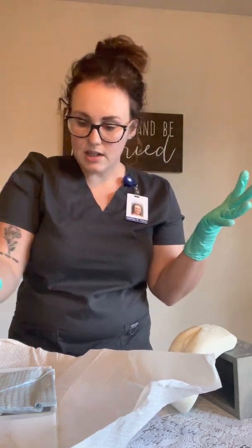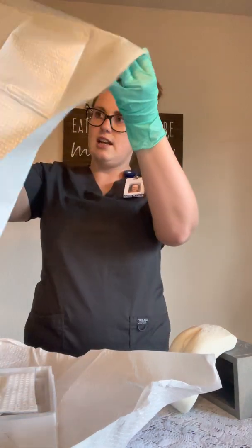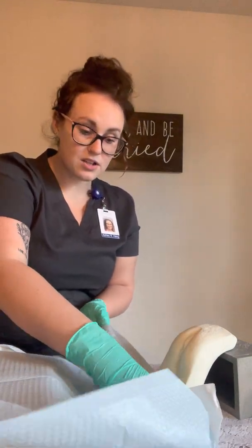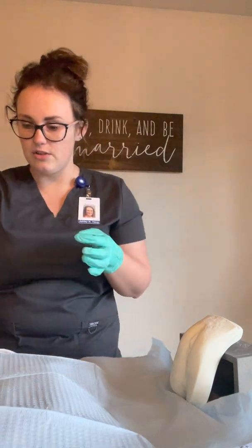Okay, so now that I'm sterile, I'm going to take the drapes, just touching the corners, and I'm going to hold my hands in so I'm still touching sterile to sterile. I'm going to ask my patient, can you go ahead and lift up your buttocks so I can lift up your hips there so I can get this underneath you. Okay, I've done that without touching my patient so I can maintain a sterile field.